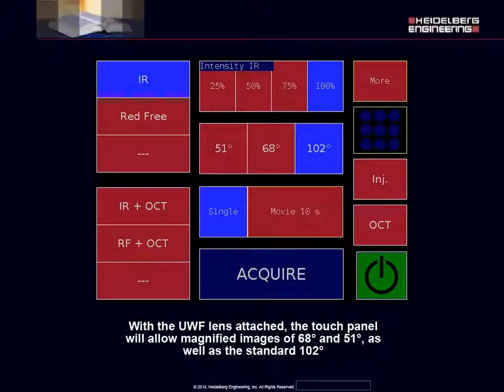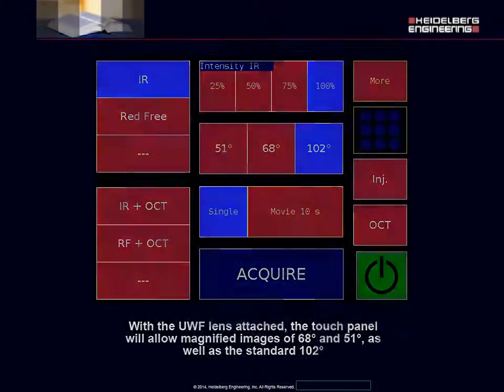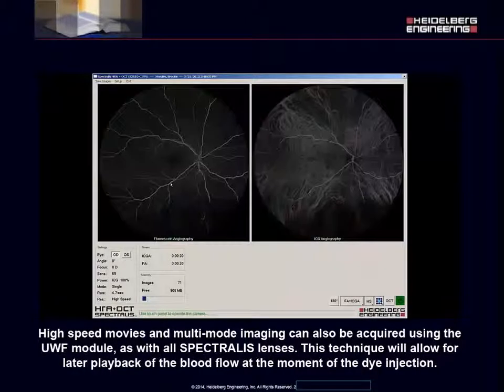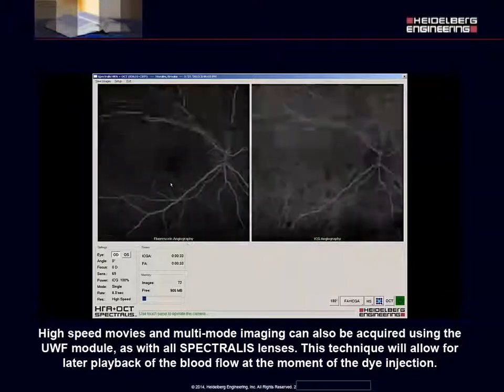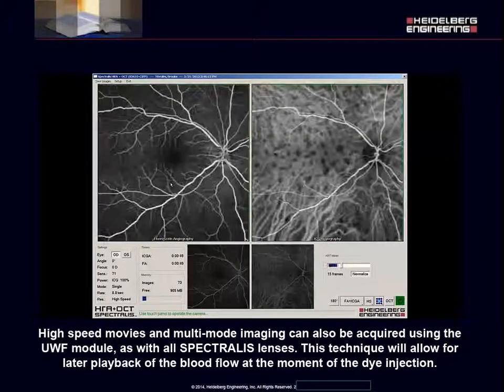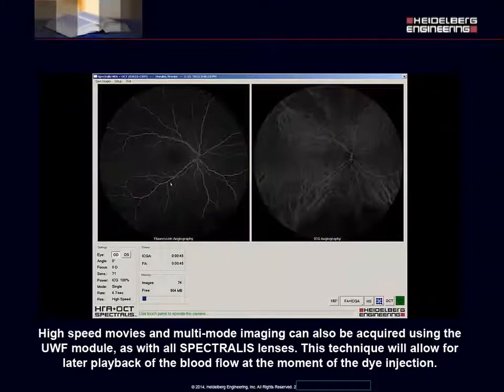With the Ultra Wide-Field lens attached, the touch panel will allow magnified images of 68 and 51 degrees, as well as the standard 102 degrees. All still images after the initial transit should be acquired with ART activated in order to eliminate speckle noise and increase image contrast and quality. High speed movies and multi-mode imaging can also be acquired using the Ultra Wide-Field module, as with all Spectralis lenses. This technique will allow for later playback of the blood flow at the moment of the dye injection.